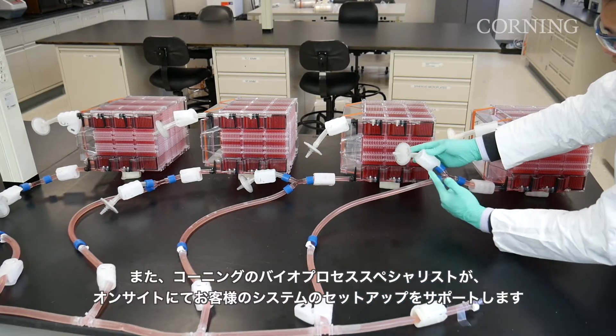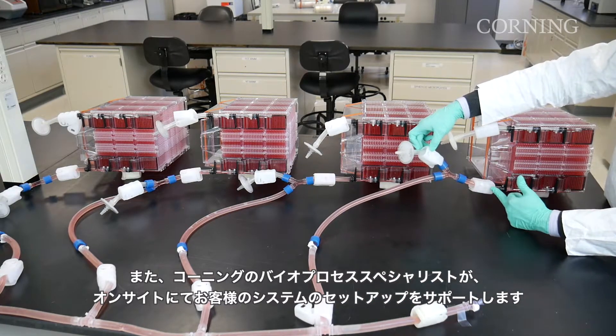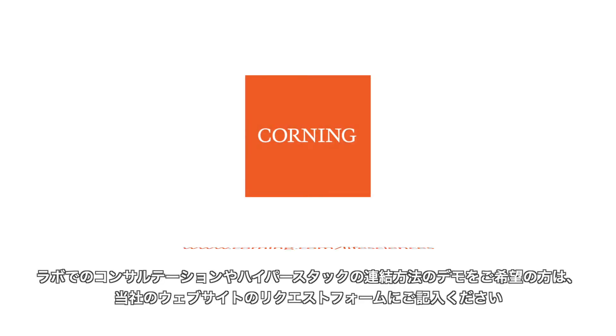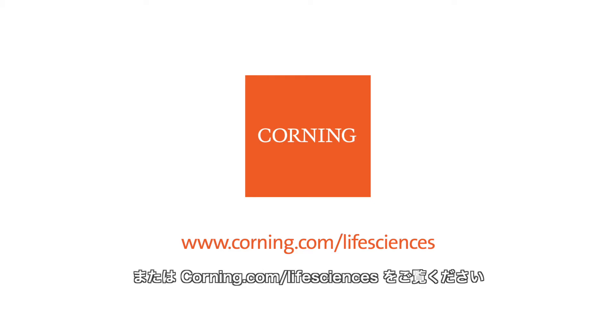Corning Bioprocess Specialists provide on-site technical assistance to help you set up your system. For an in-lab consultation and demonstration of how to manifold HyperStack, please fill out a request on our website. For all other questions about HyperStack and its uses, please contact your Corning Bioprocess Specialist or visit corning.com/life-sciences.